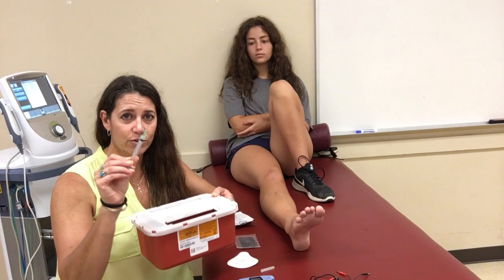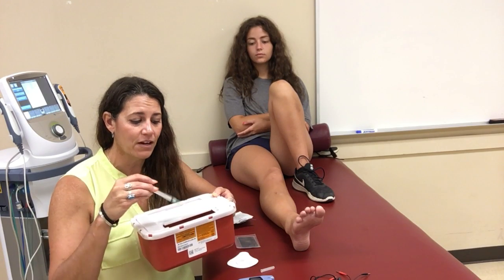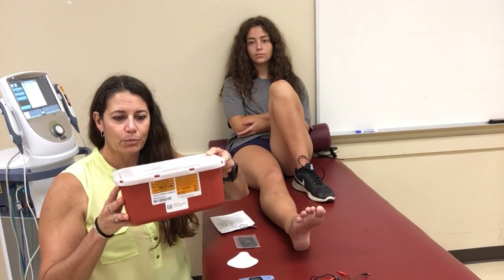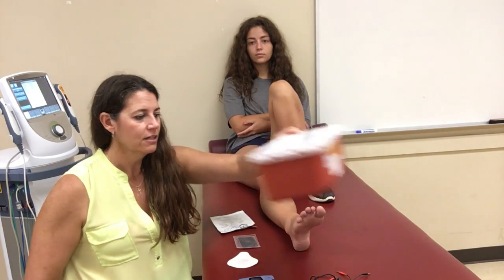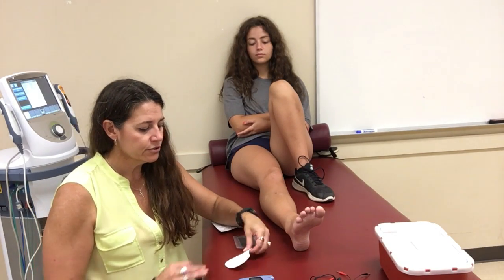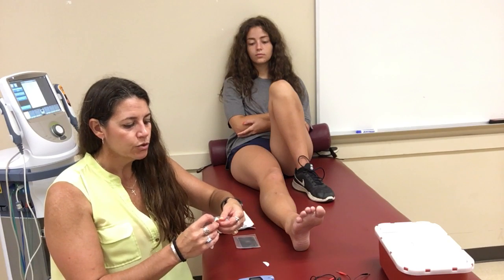Important: you need a sharps container, and your used needle goes directly in it. Do not recap the needle — that's a $250,000 fine per recapped needle found. Put it in the sharps container and do nothing else with it.